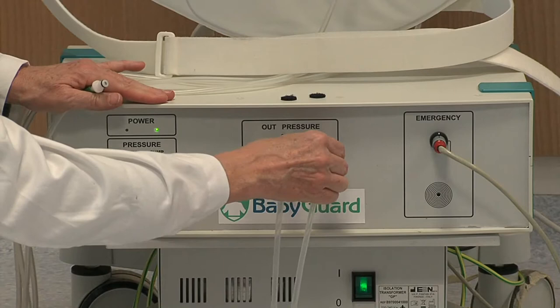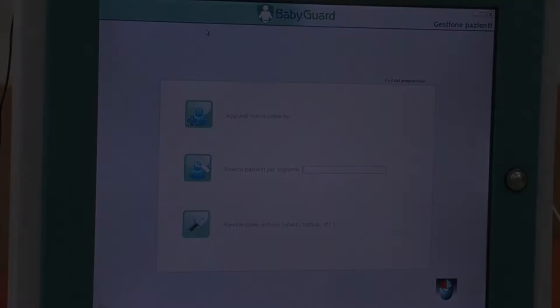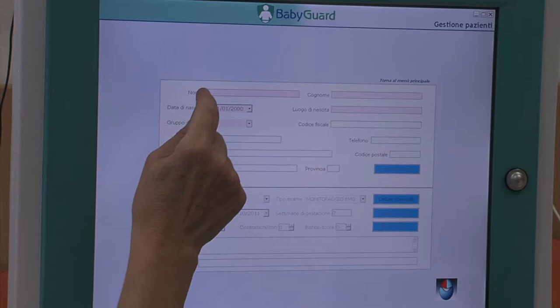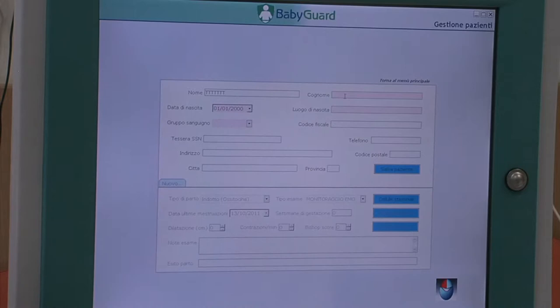Successivamente si collegano i tre tubicini al box di gonfiaggio. Poi viene impostato sul monitor del PC l'anagrafica della partoriente. Vi sono informazioni obbligatorie come il nome, il cognome.